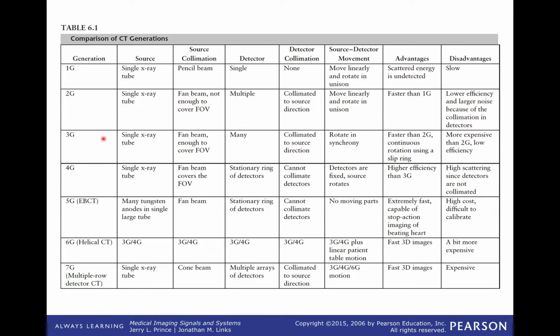An X-ray, you stand somebody in front of an X-ray film to take a diagnostic X-ray shot, and it takes milliseconds, right? And now you say, I have this technology that will take half an hour per patient, will give them 500 times the dose of an X-ray image, and it will cost maybe 15 times that. You say, okay, would you invest in that technology? So you have to have front-end believers when it doesn't look great, right? To get it to this point where it just crushes everything else.